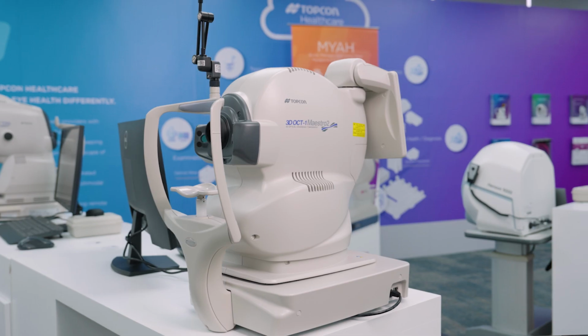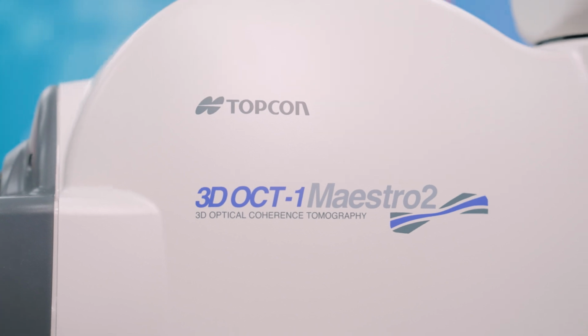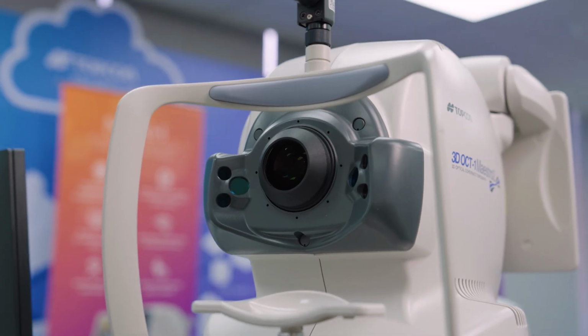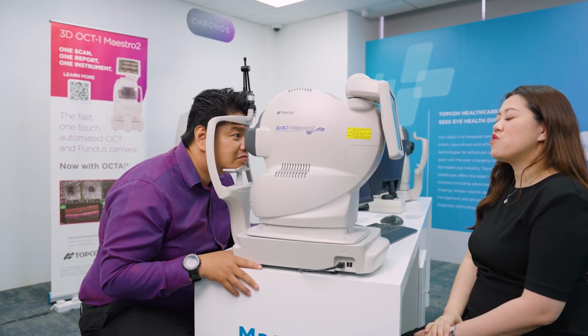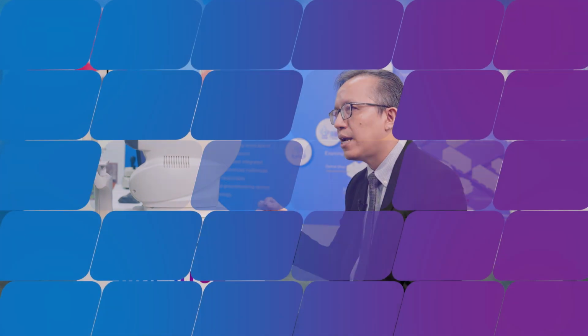Basically, as an optometry clinic, we actually have quite a number of devices, a lot of instruments that are involved. Yeah, this actually is an OCT. So basically, we use the instrument whenever we have a doubt on the patient's retina, or a doubt about the back of the eye. For patients that we suspect cannot see because of certain diseases, we usually will use this Maestro in order to help us identify if there is any pathological sign.